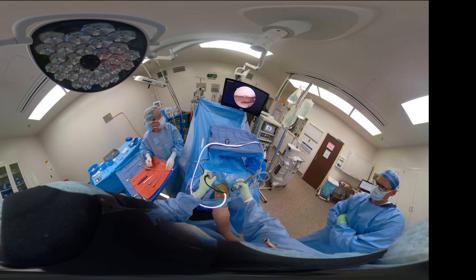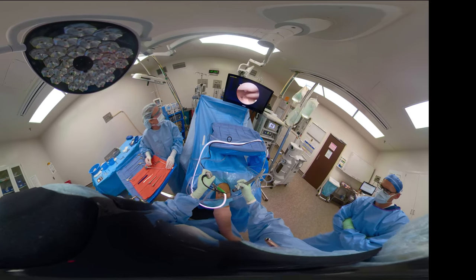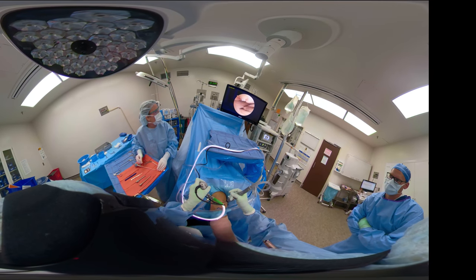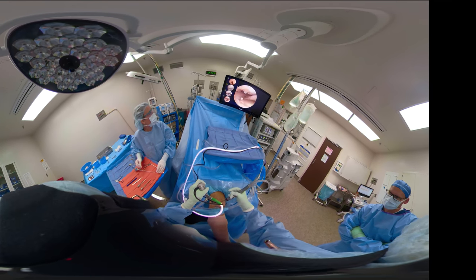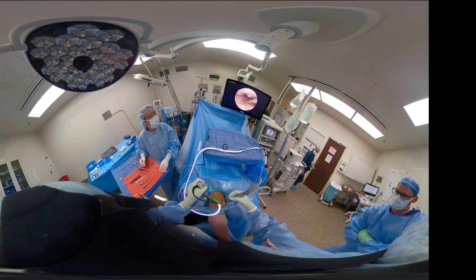The curved shaver is being used to bevel that frayed edge of the lateral meniscus, but this really isn't the problem. The meniscus is fine to probing. You can see I just took a picture. We take a picture on the camera head. We can record, take a picture.